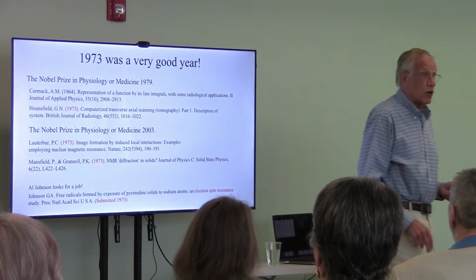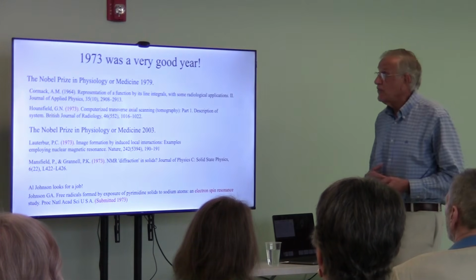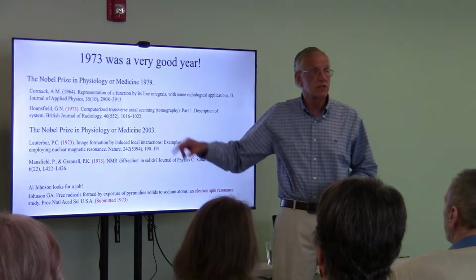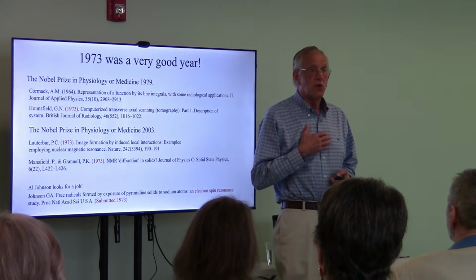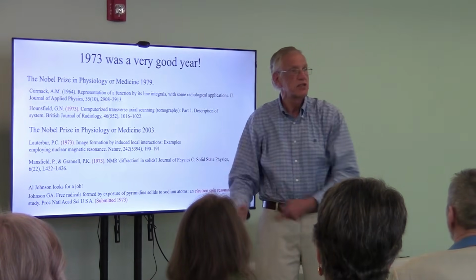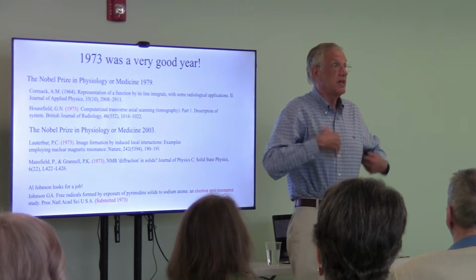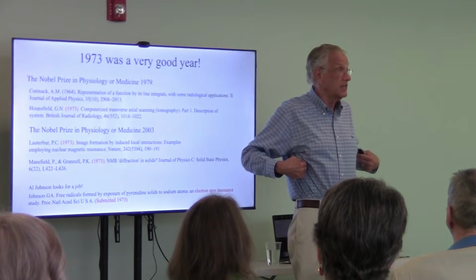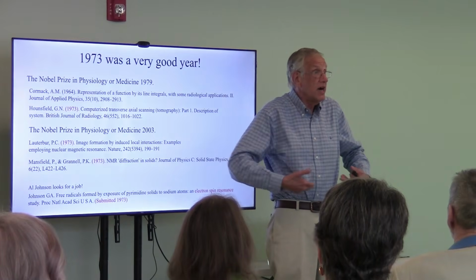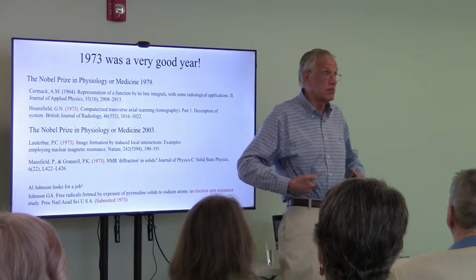CT caught on earlier, quicker. It was an easier technology to master. And the thing that CT brought to the party was transverse axial scanning. Up to this point, when you went to get an x-ray, you put your hand in front of a film, x-rays came in, you got a projection of your entire hand. You stood in front of a cassette, x-rays came in, you got a chest film, but you didn't get a slice. What CT said was, I can give you a single thin slice. So suddenly transverse slices were possible.